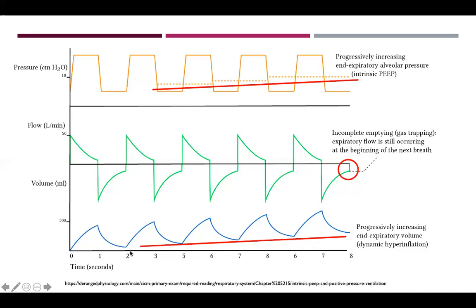And then on the volume curve, you can see something similar, where you get that slow uptick in the volume based on the stacking breaths.